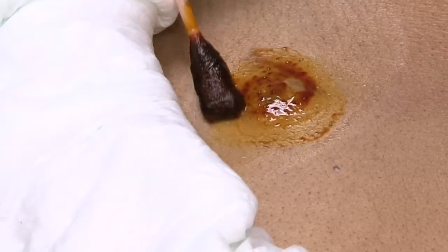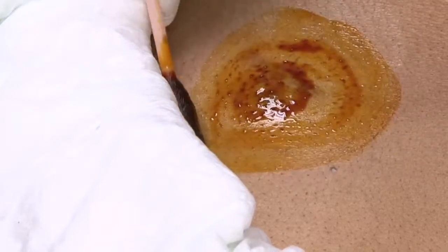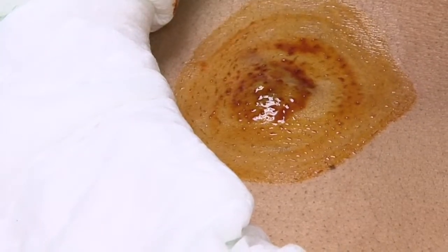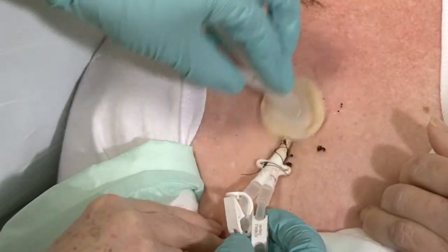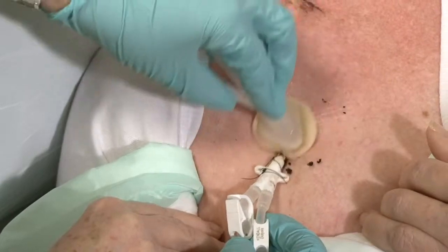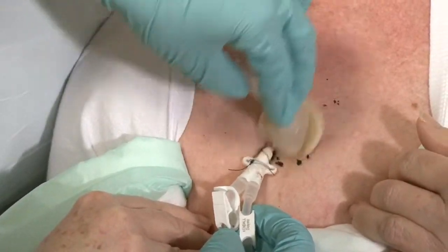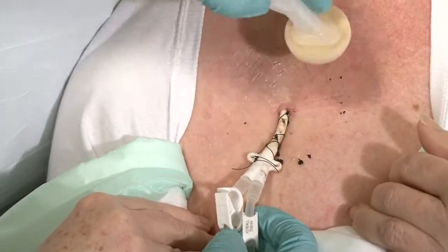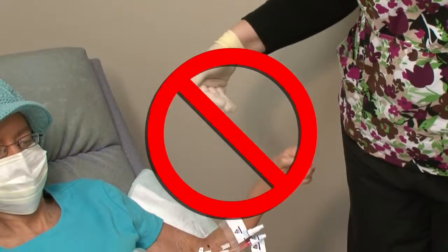If you have an allergy or sensitivity to chlorhexidine and iodine is used, it will be allowed to air dry completely and then will be wiped off with saline or sterile water. This may take a minute or more. The care provider will scrub the catheter exit site with the disinfecting solution using gentle friction for at least 30 seconds to ensure that the disinfectant is most effective. The solution should be allowed to air dry completely and should not be fanned or blown on.